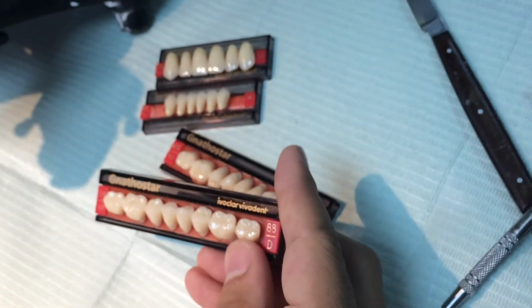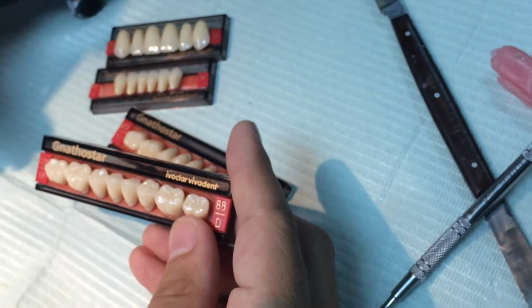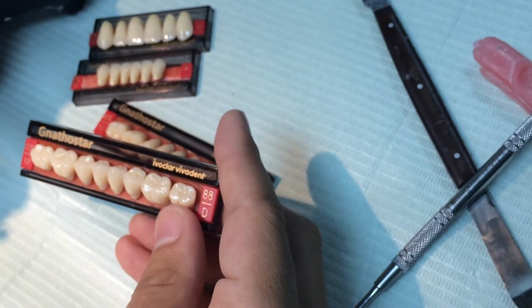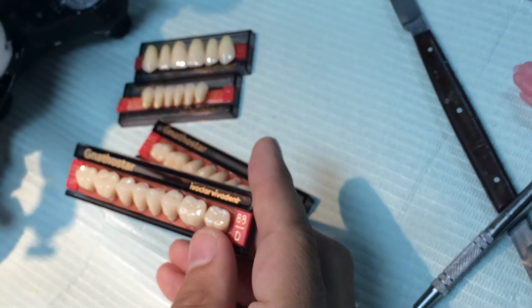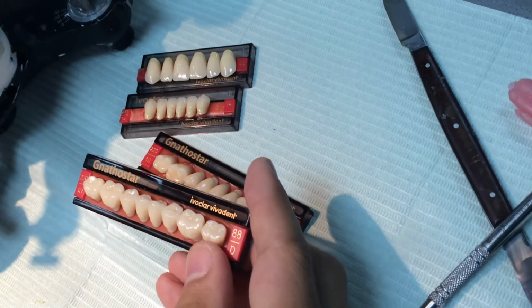Also for the lower posterior, I'll check the letters and numbers so I can read them. So the teeth are coming from down going up, meaning I can read what's there. And these teeth are coming from down going up, meaning it's posterior lower teeth.